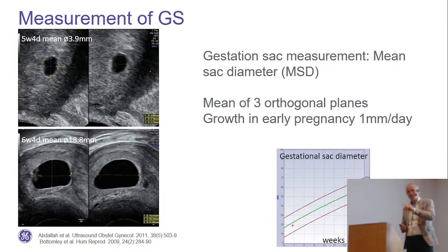And it also saves you scanning time. And of course, in the early pregnancies, as low as reasonably achievable is so important also in ultrasound. And you want to have as little exposure to ultrasound in very early scans. So why not make a very fast 3D and then you can measure? So everybody knows now how to do this.